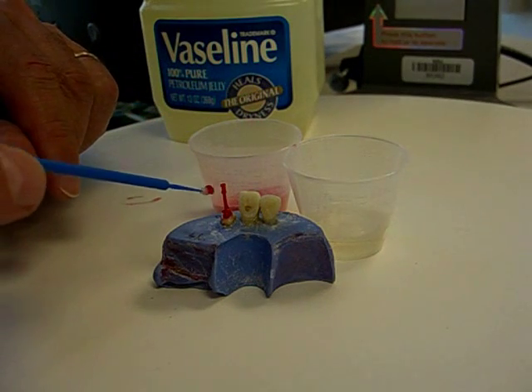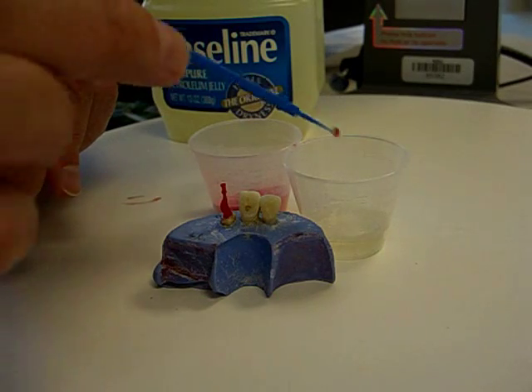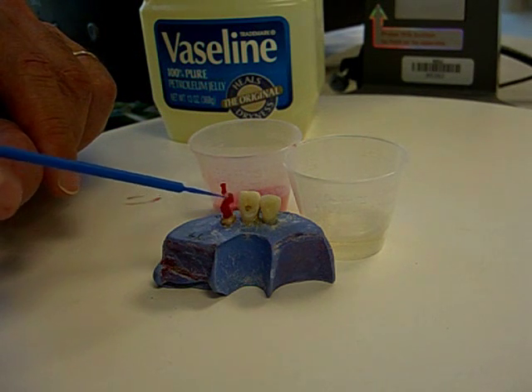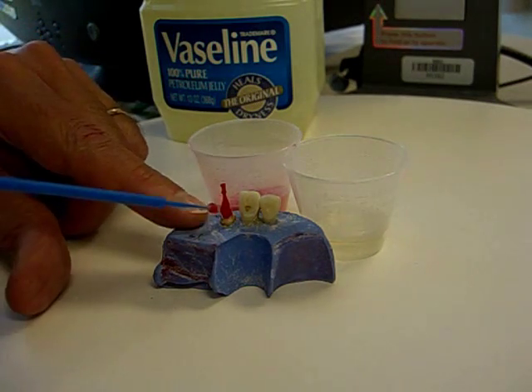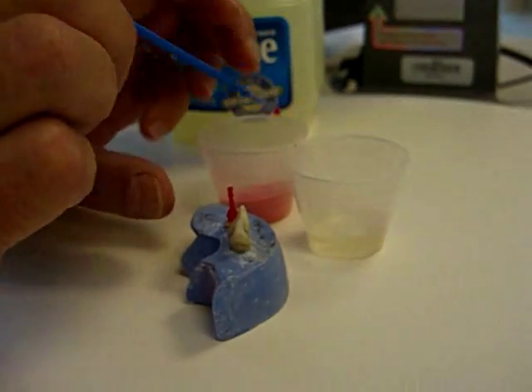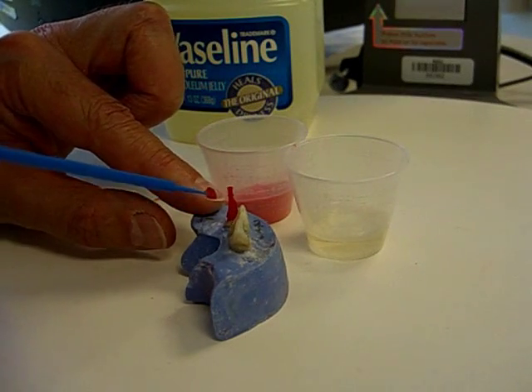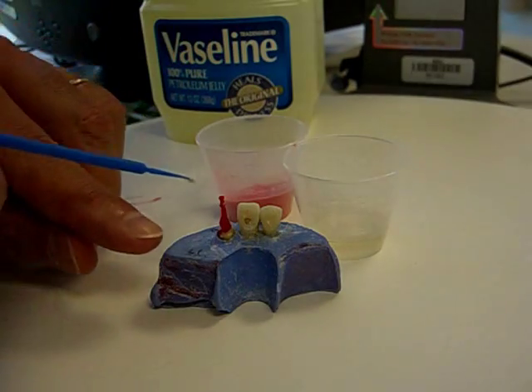I've taken a small quantity of material and added it to the sprue first. No doubt what happens in the beginning is the material will begin to slump. So as you're adding, you're also using your brush to shape the material as it slumps. Use a dry brush and wipe it off.